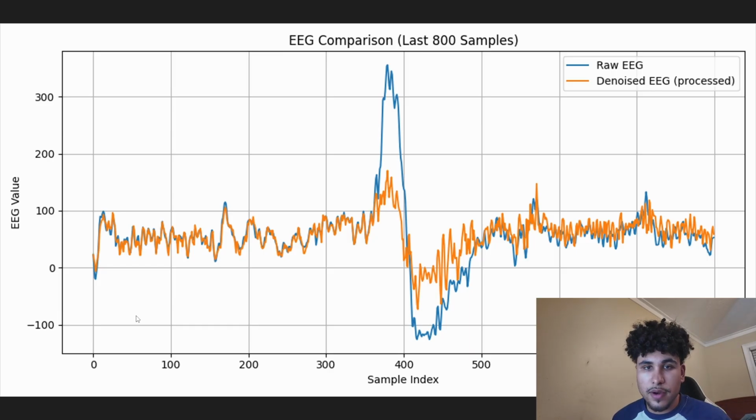So that's really important when it comes to opening and closing a prosthetic arm with your mind. Now, as I said earlier, it struggled with localized artifacts, and if you take a look at this, it did attempt to denoise the signal generated from blinking, but because it attempts to denoise the entire signal, it incorrectly reconstructs the signal later down the line after that artifact is presented.